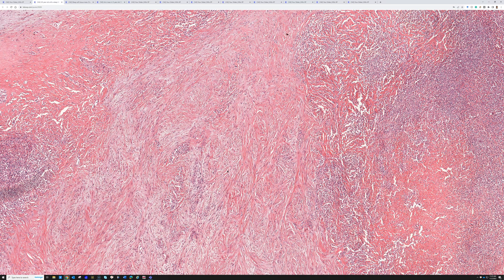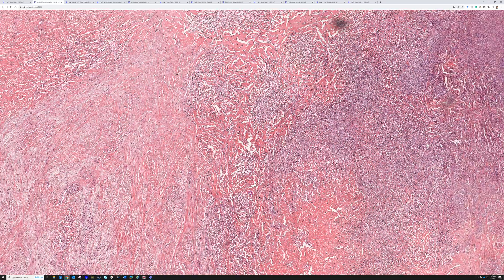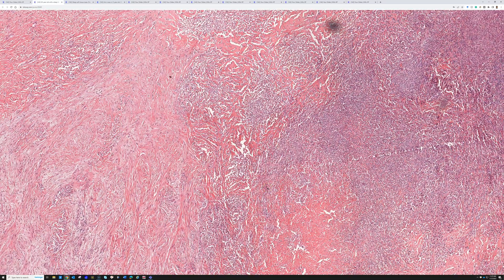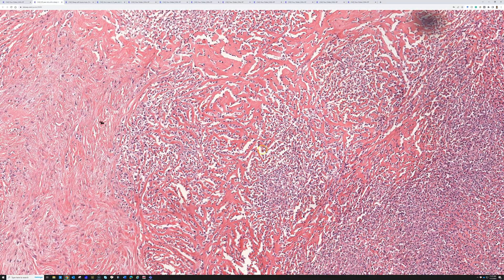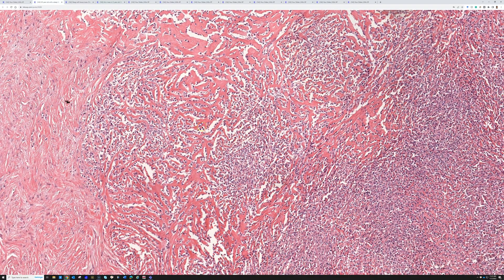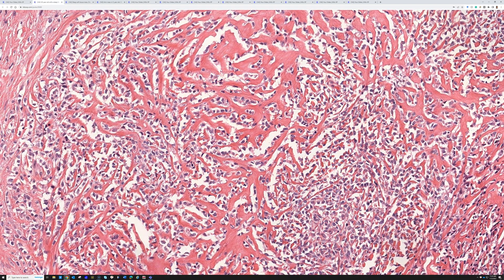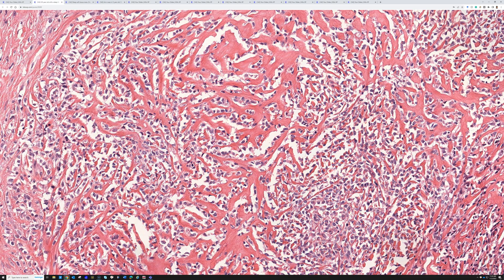There's still some debate over the relationship between these two entities, but I believe there is some sort of connection between them. It's important to recognize this tumor because the cord-and-chain pattern in sclerotic collagen is quite unusual for soft tissue tumors. On a small needle biopsy, you could even be tempted to think about a carcinoma, like lobular breast carcinoma infiltrating background collagen.